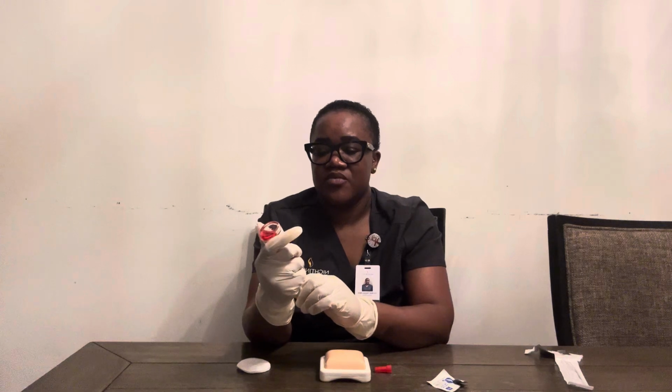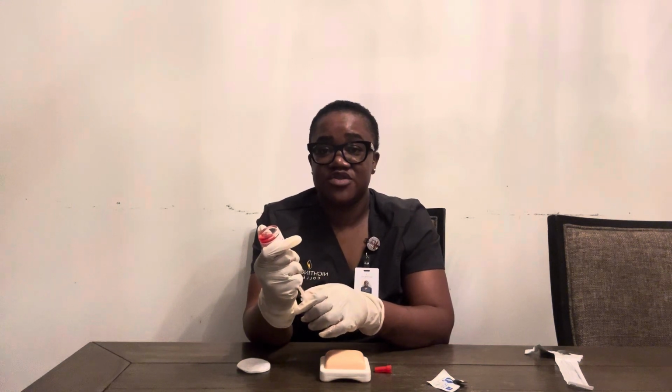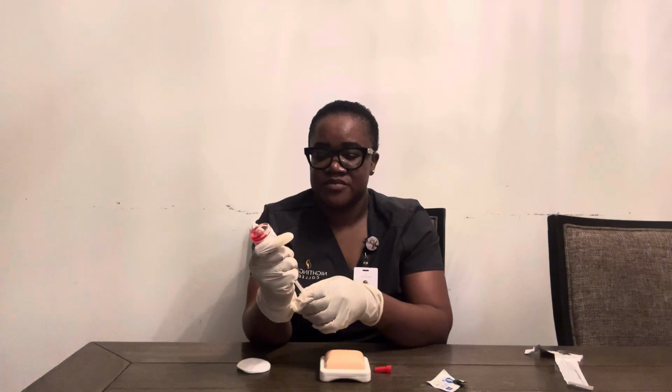All right, so now I need to withdraw my medication, which is supposed to be 0.1 ml. I'm gonna tap for any bubbles.